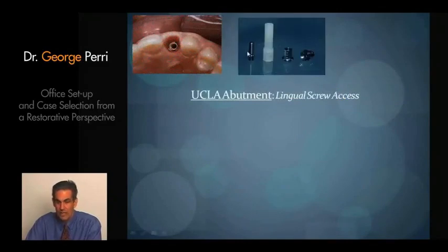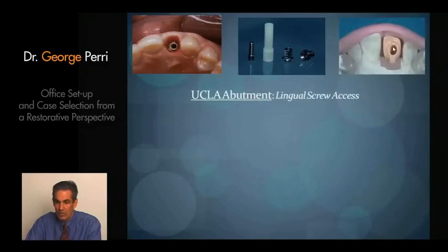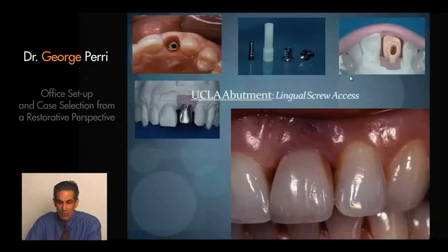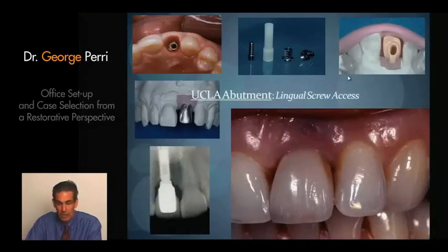We see a case with the head of the implant. We've decided to use a UCLA abutment. We do a full contour wax casting, cast it, bake our porcelain, and really it's a screw retained crown. It's simple. What are the debates that we might have in today's world?